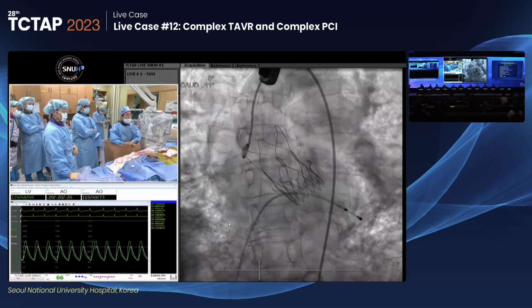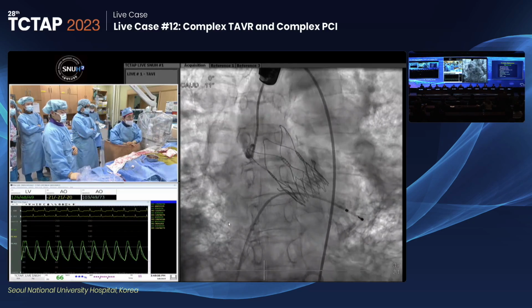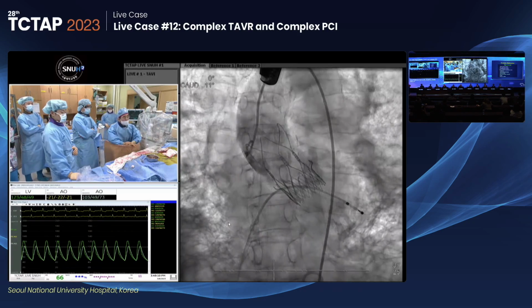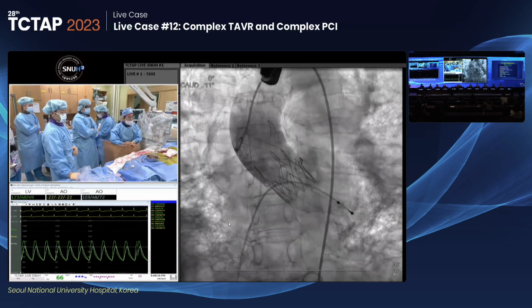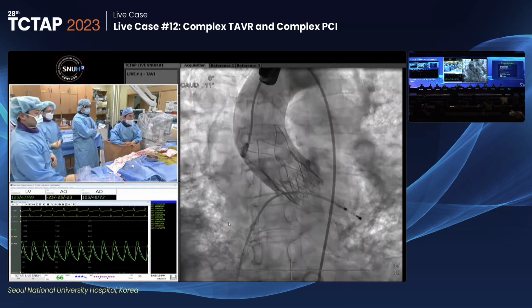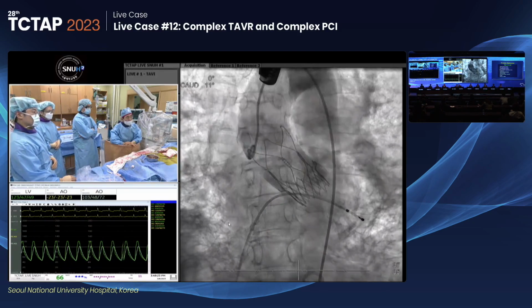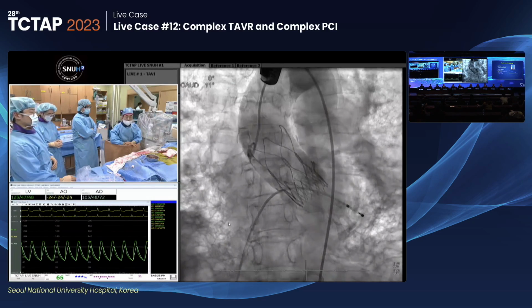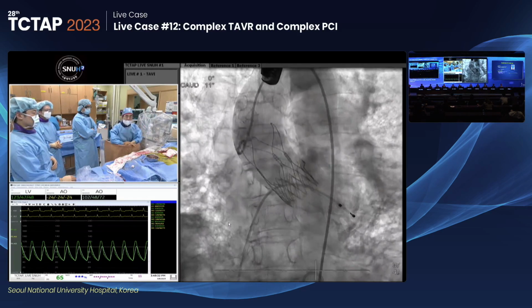First, let me conclude the Accurate Neo TAVI live demo. I think, as I showed before, there are most common clinical conditions to favor the Accurate Neo. Thus, I think Accurate Neo has good things from both Sapien and Evolut. Thus, I expect Accurate Neo may be a workhorse for TAVI procedure.